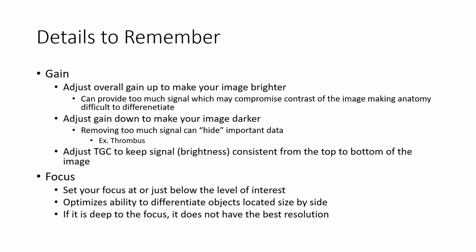Another really important tool on every console is the focus. The focus allows you to maintain optimal lateral resolution, which is the ability to differentiate between two objects of anatomy side to side. We're going to have optimal lateral resolution to differentiate two objects side to side at the level of our focus. So if you're looking at something at a specific level, you always want your focus at or just below that level. Anything distal or beyond the focus is going to have a gradual decrease in resolution.